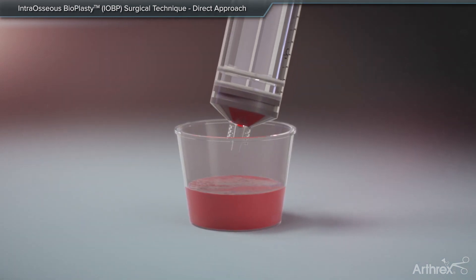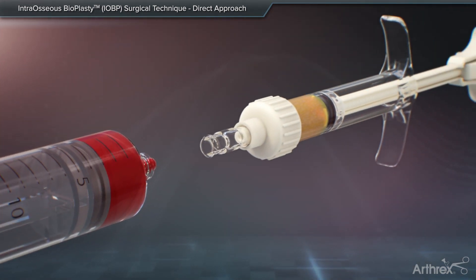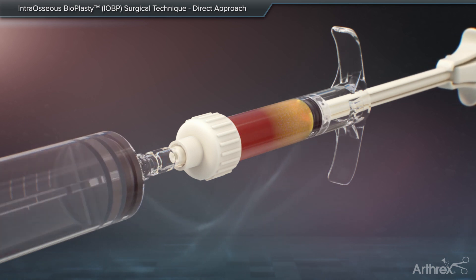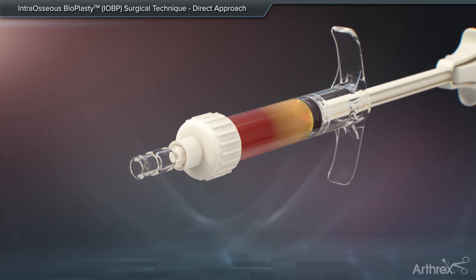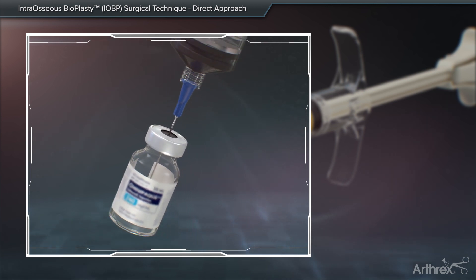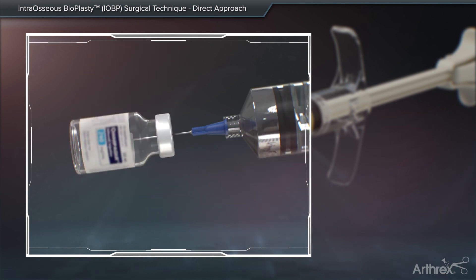The BMC is transferred into a separate sterile basin and drawn into a syringe. The mixing and delivery syringe is filled with demineralized bone matrix gel. Then, a female-to-female luer adapter is utilized to connect the BMC syringe. Optionally, contrast may be utilized to aid in visualization of the graft during backfill of the core decompression site.